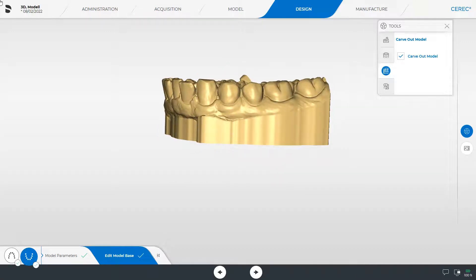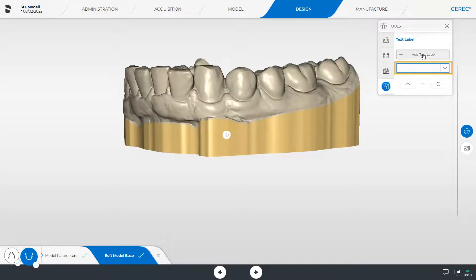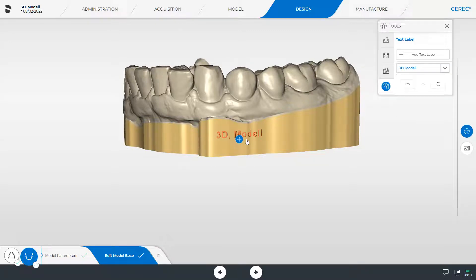Now we come to the last tool: text label. This assists with the correct allocation of model and patient. By tapping add text label, a drop-down menu opens. Here, two CEREC software text suggestions are displayed based on the information entered when the case was set up. We select a proposal and place it on the base of the model.